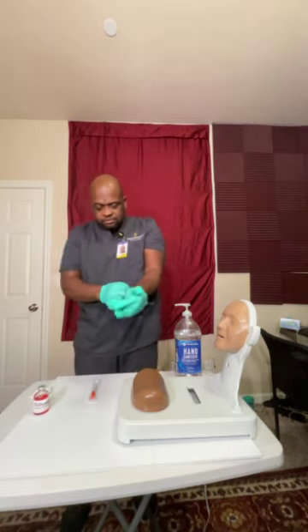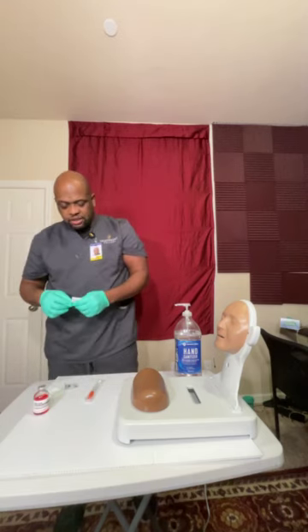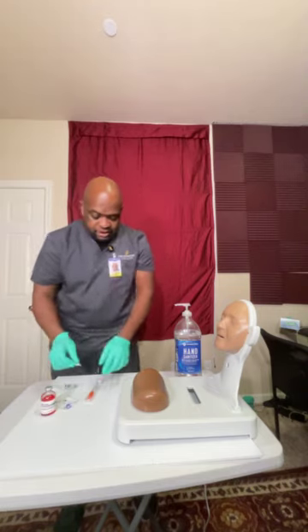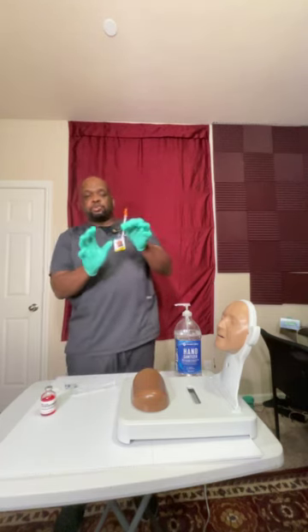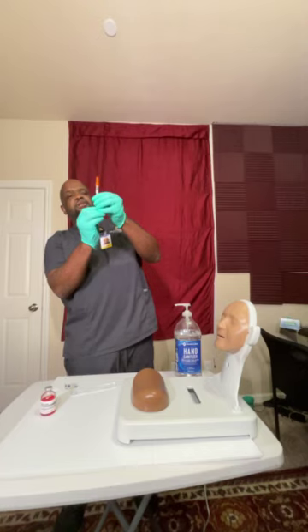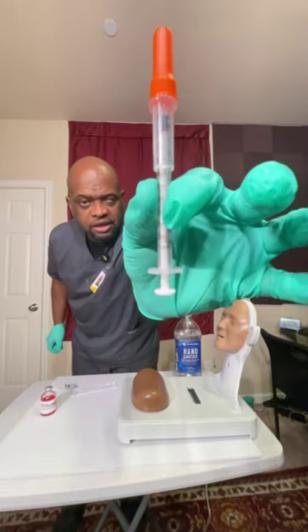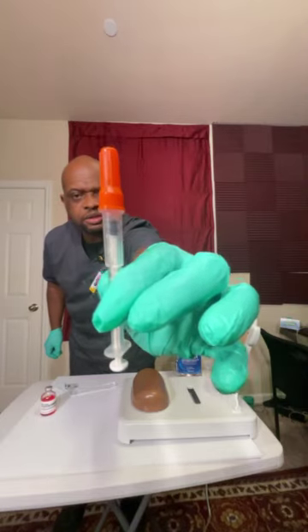All right. So what I'm going to do is I brought alcohol wipes because I need to clean the top of the bottle. Okay, let that air dry. And put this in the trash over there. And then for the syringe, with the cap still on, I'm going to draw in 0.1 milliliters of air. There we go. With the 0.1 milliliters of air, that's what it looks like. Let me turn that syringe so you can see it better. I know it's hard to see.